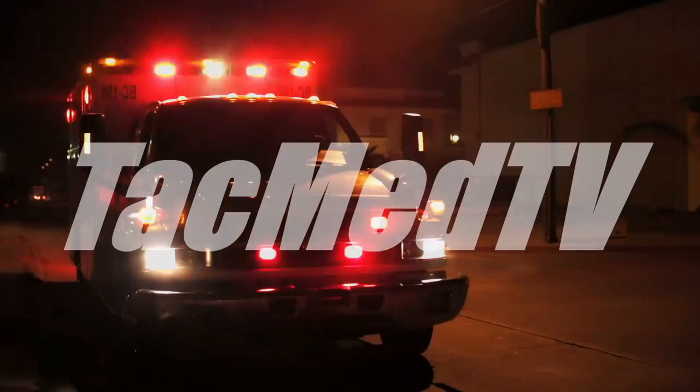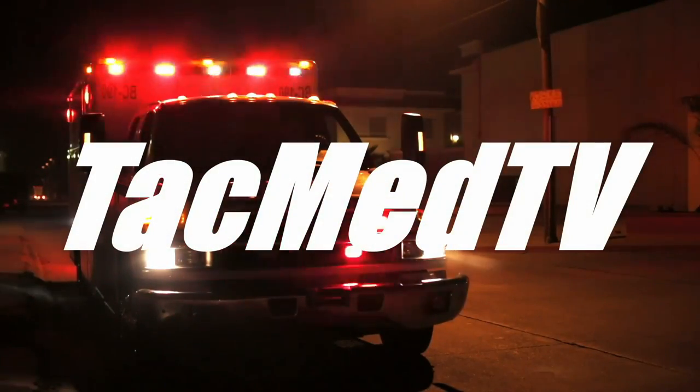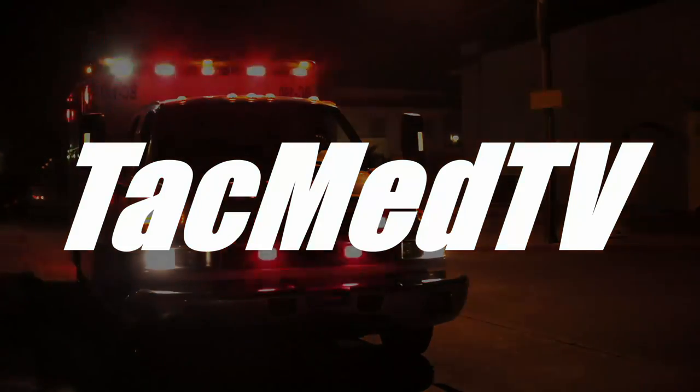Hi folks, got something real interesting for you today - the IT clamp, next on TacMed TV. Welcome to TacMed TV, my name is Steve, and today I'm bringing you a product called the IT clamp. We're going to stay in the vein of bleeding control talking about this today. This is made by a company called Innovative Trauma Care.